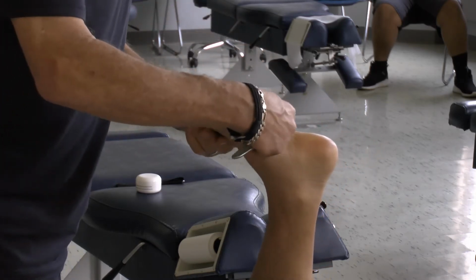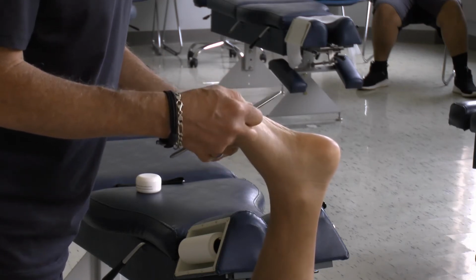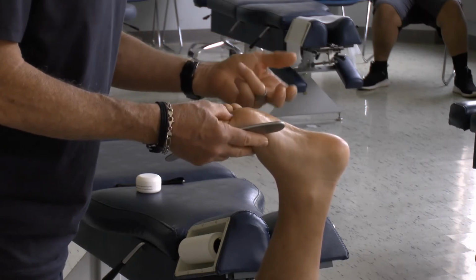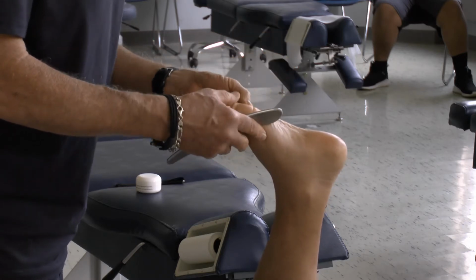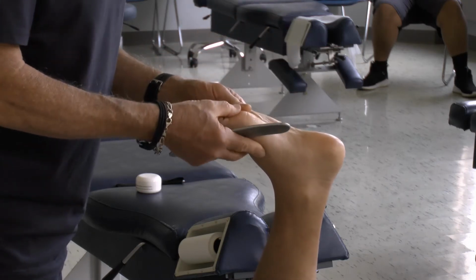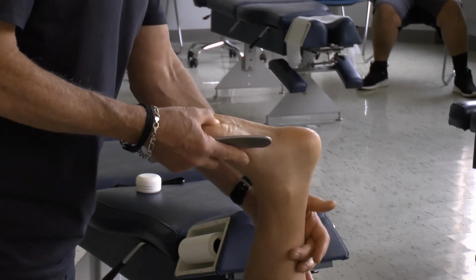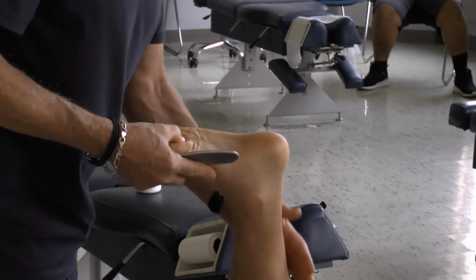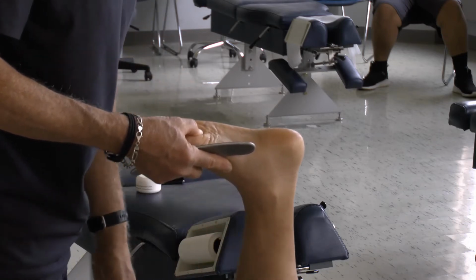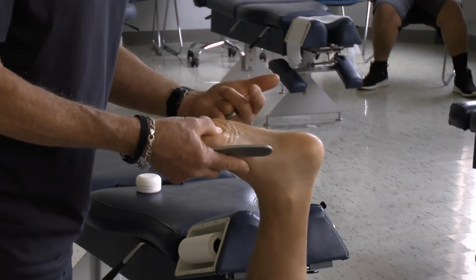Plantar fasciitis generally responds very well to a combination of manipulation, instrument-assisted connective tissue techniques like ConnecTX, which is what we're using now, and rehabilitative interventions like restoring dorsiflexion and increasing the pliability and flexibility of the gastrocsoleus group, looking for overpronation syndrome during gait.